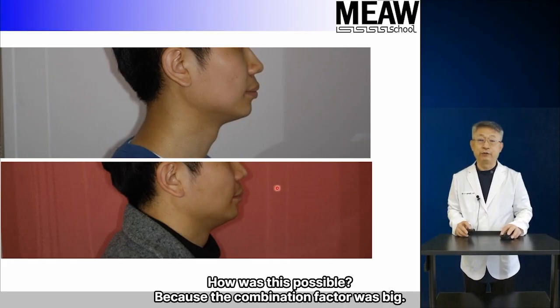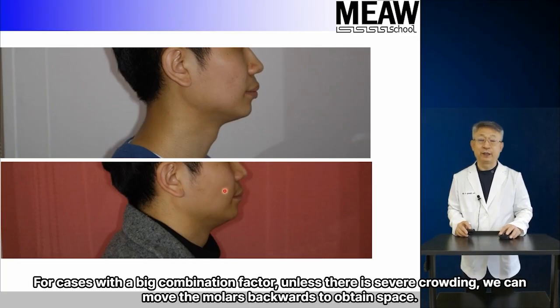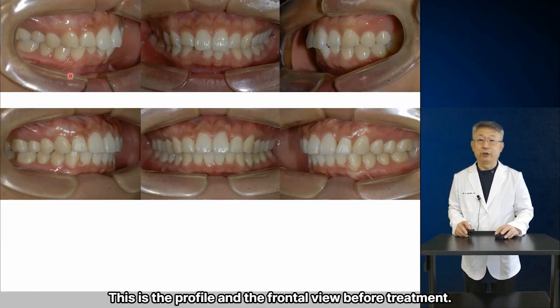How is this possible? Because the combination factor was big. If this patient had a small combination factor, we would have had to extract the premolars. For cases with a big combination factor, unless there is severe crowding, we can move the molars backwards to obtain space. If there is a possibility of labioversion of the mandibular incisors due to force vector, we can use mini screws. This is the profile and the frontal view before treatment.